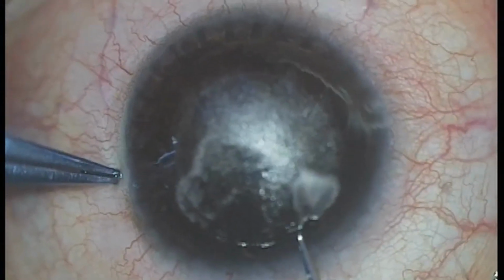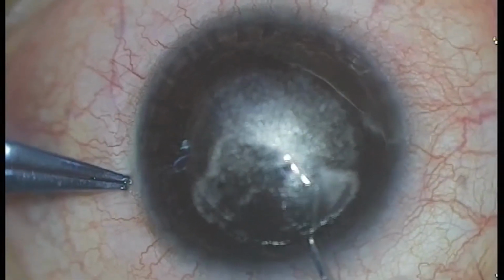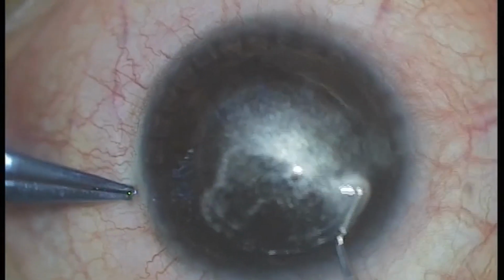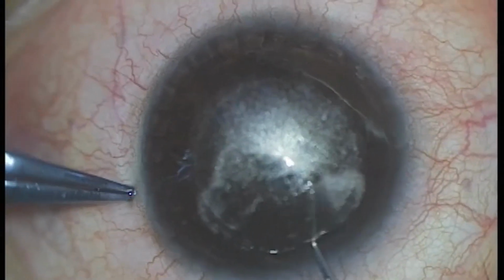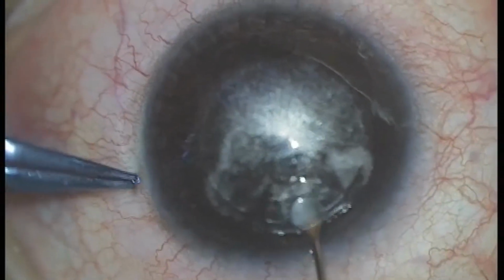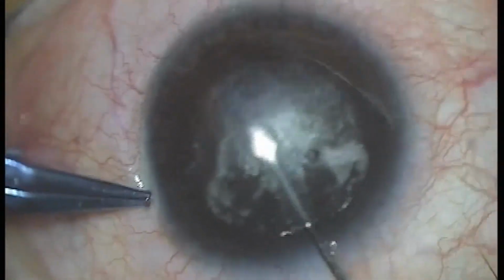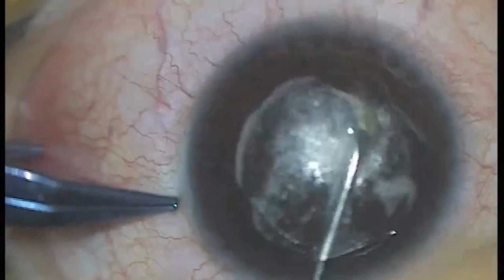The lenticular edge on one side was gently scratched with the hooked end of the dissector to find the anterior lenticular plane. Once the plane was identified, one could notice the separation of lenticule from the cap. Thereafter, the blunt dissector was used to dissect the anterior lenticular plane followed by posterior plane through the posterior channel.